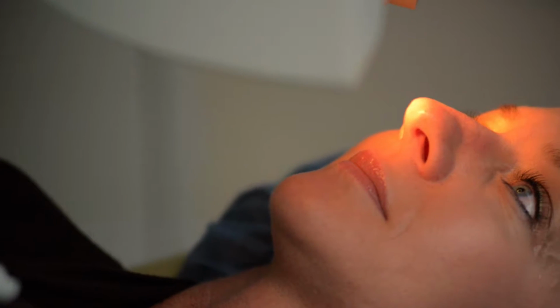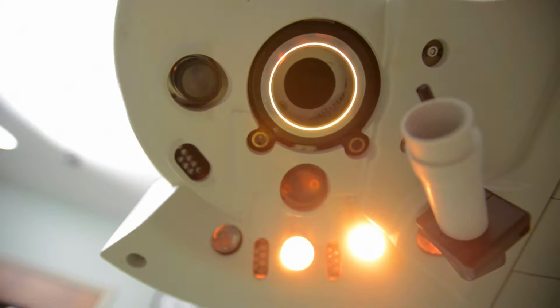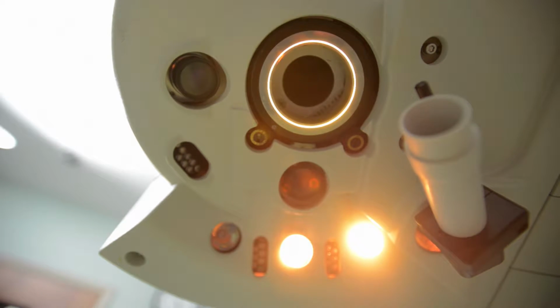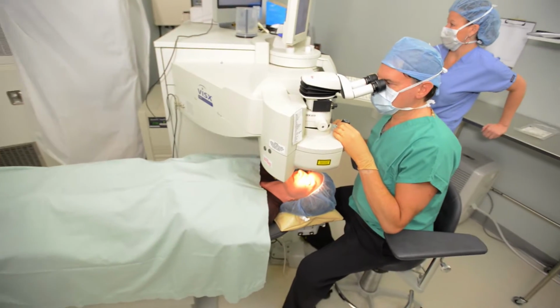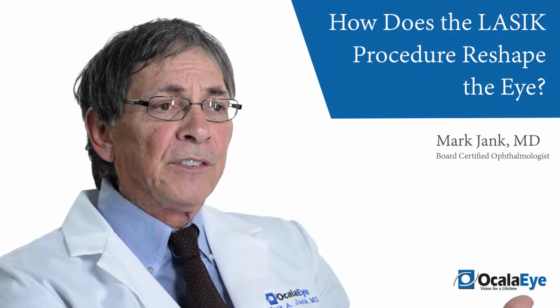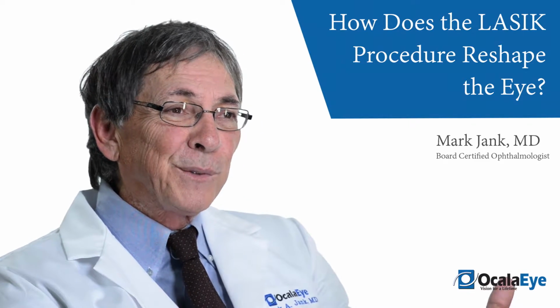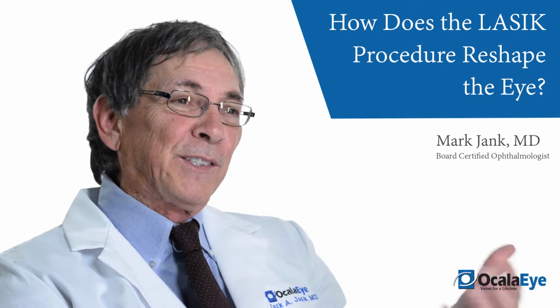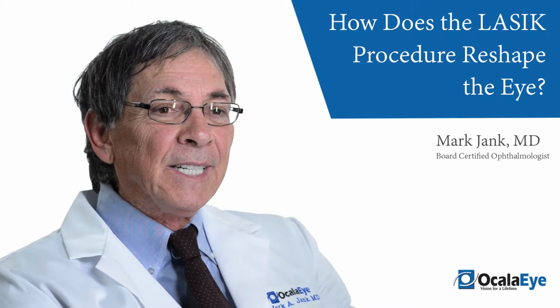To do the laser, as a patient, you just look at a red light. The computer is making sure that you continue to look at the red light. We have tracking mechanisms in the laser. If you happen to look away from the red light when the laser's turned on, the computer senses that, shuts down the laser. The doctor typically says, hey, what are you doing? Let's look at the red light. The patient goes back to the red light, and then the treatment picks back up again.